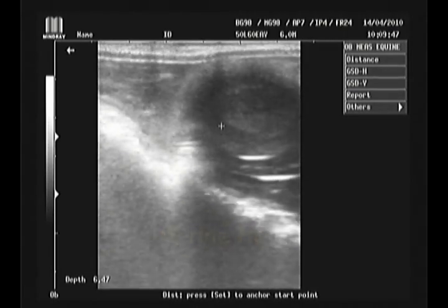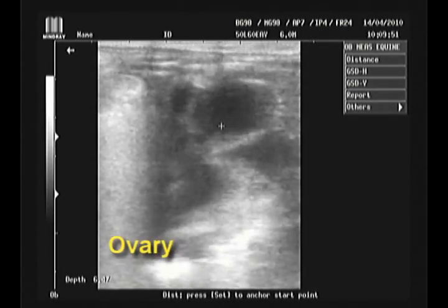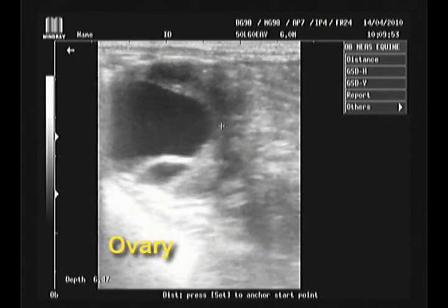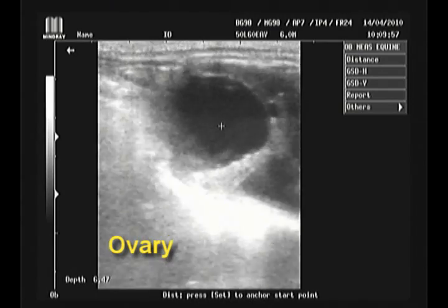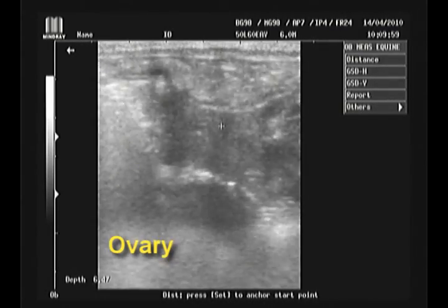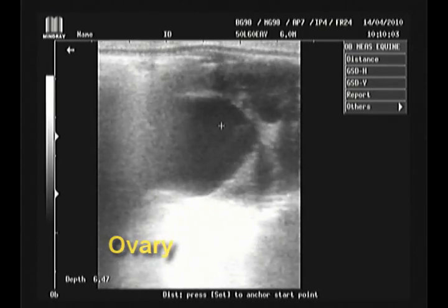Follow that uterine horn up until it disappears. Once it disappears, continue to rotate upward until you run into the other ovary. Again, scan all the way up until the ovary disappears. Once it disappears, rotate back downward until it disappears again, ensuring that you found the largest follicle.